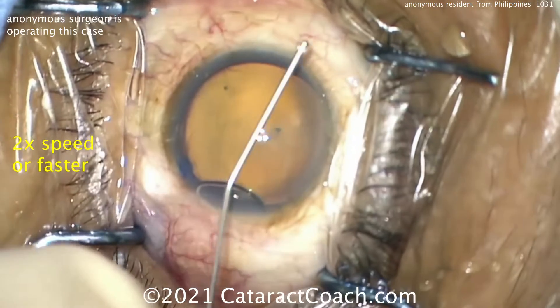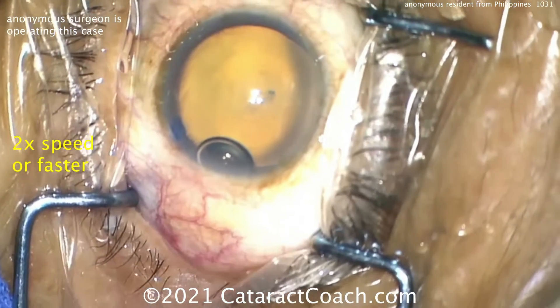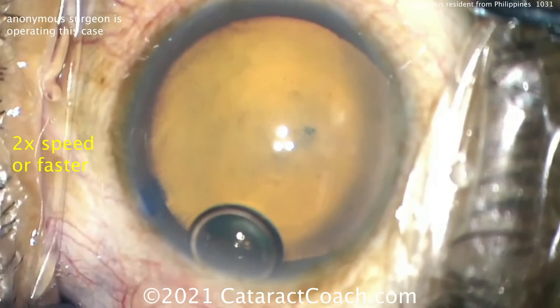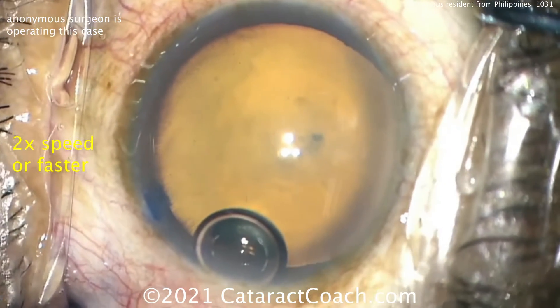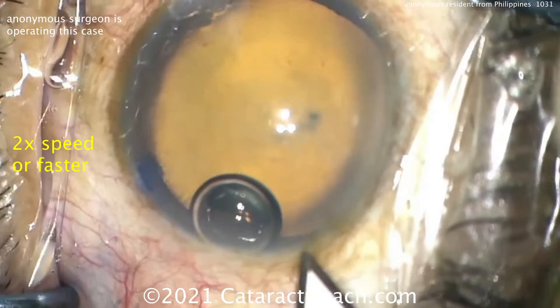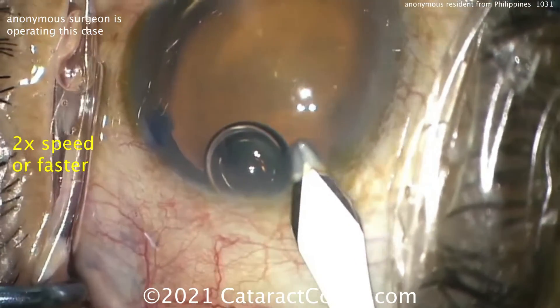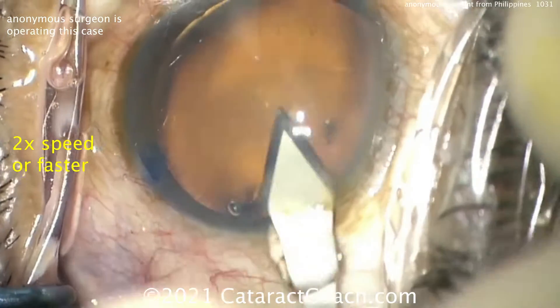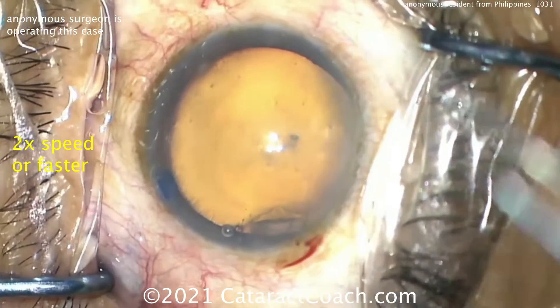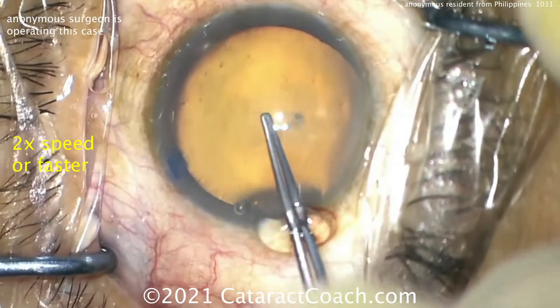Looks very nice — good fill, good pressure. I like the checking of the pressure. Remember, if the pressure is very high your incision is going to be shorter than you think, and if pressure is really low you'll have a really long incision, maybe too long. Zooming in here, the keratome placement and advancing tunnel length looks pretty good. There's a little bit of a chevron appearance at the tip, so maybe a little more work on that incision architecture. The tunnel length also looks a little short.